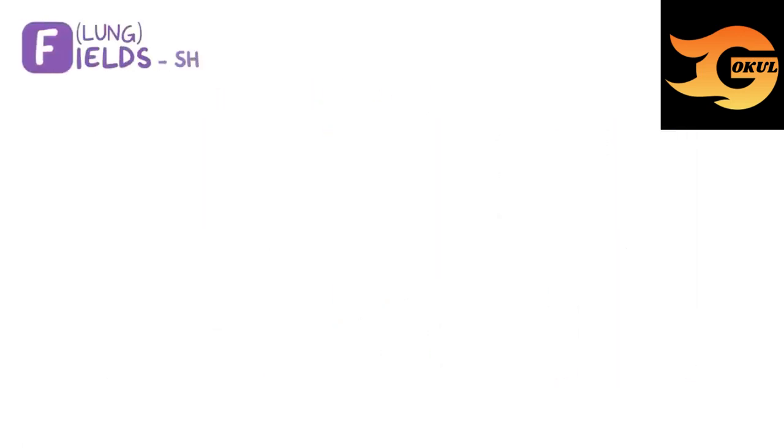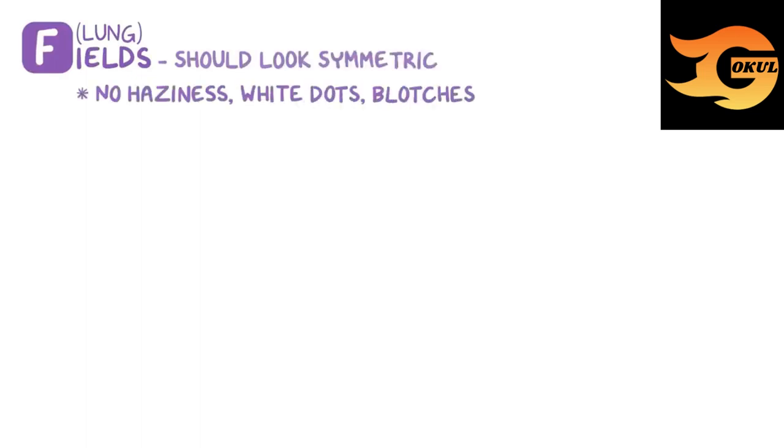F is for lung fields, which should look symmetric. There shouldn't be any haziness, white dots, or blotches.